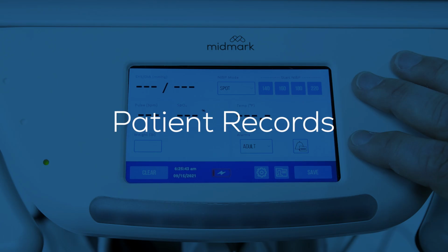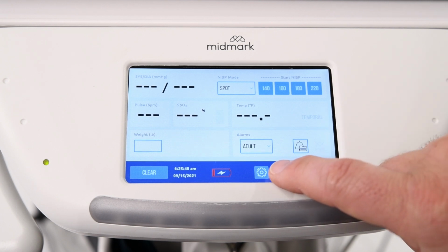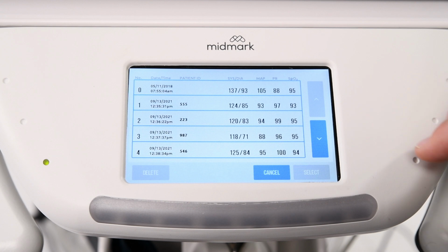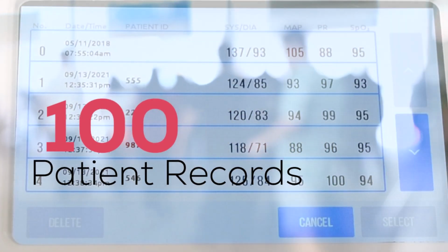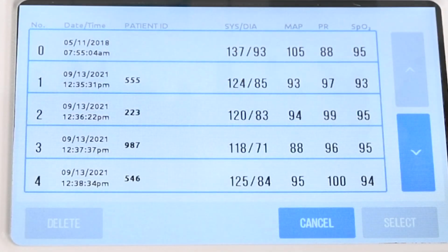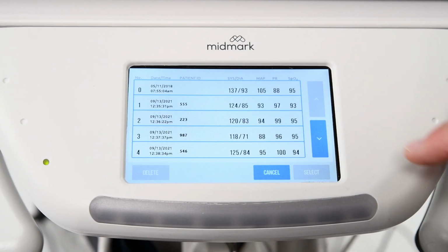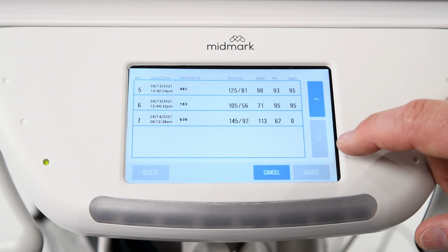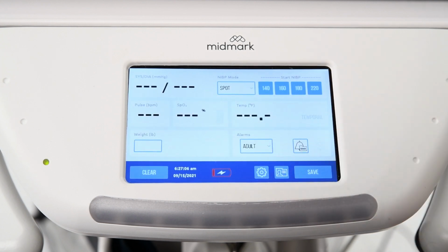Patient Records. To access all patient data that is stored in IQvitals Zone, press the Patient Records icon on the main screen. IQvitals Zone is capable of holding 100 patient records in the device memory. When the memory is full and another patient test is saved, the first saved test, which is the oldest, will be deleted in order to save the current test. To view other saved records, use the up and down arrows. To return to the main testing screen, press the Cancel button.